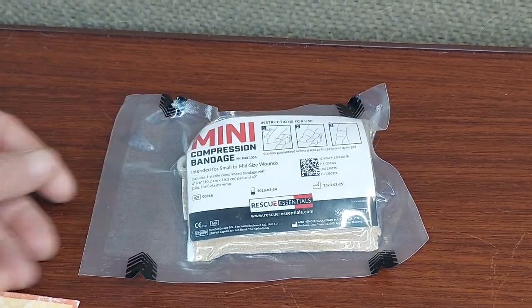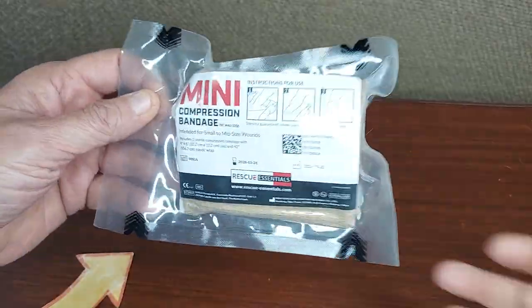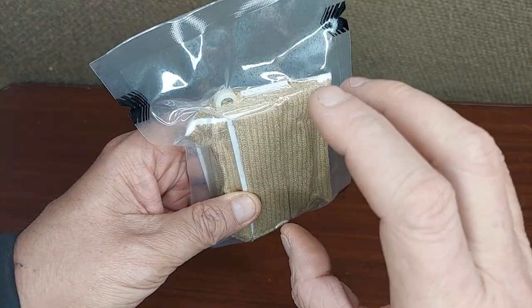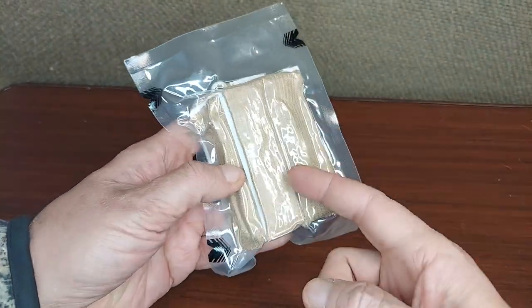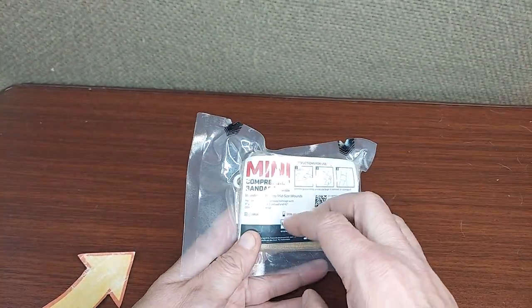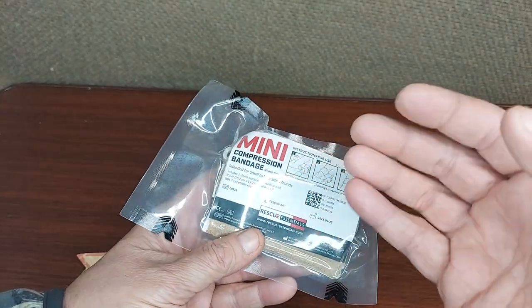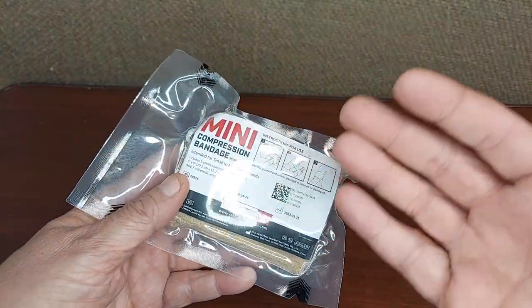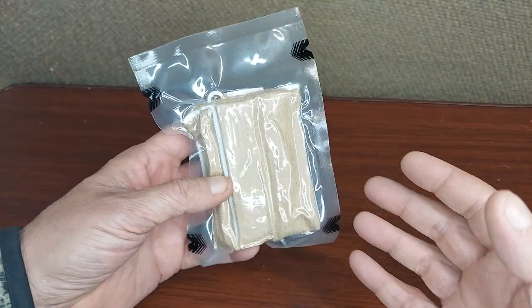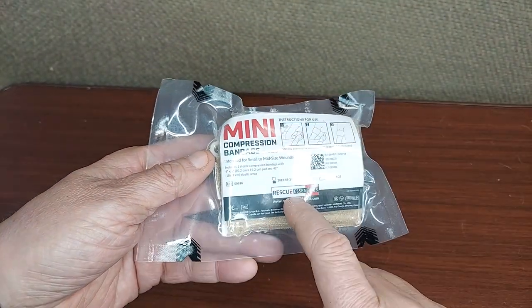Aside from a tourniquet, one of the most essential pieces of first aid or trauma care would be a compression bandage. These are really good innovations — essentially some sterile gauze with an ACE bandage attached. This way you can quickly add compression or pressure to a bleeding wound. It's also good for other things where an ACE bandage would be effective.